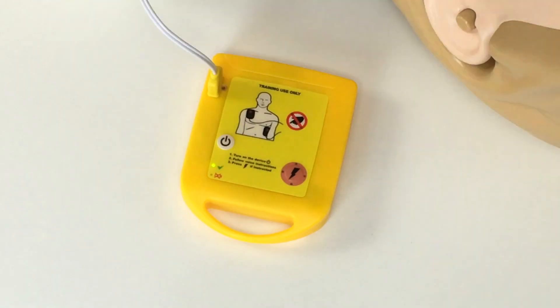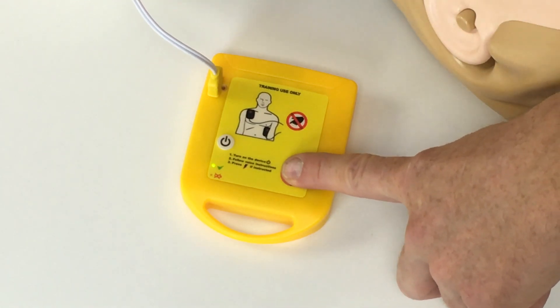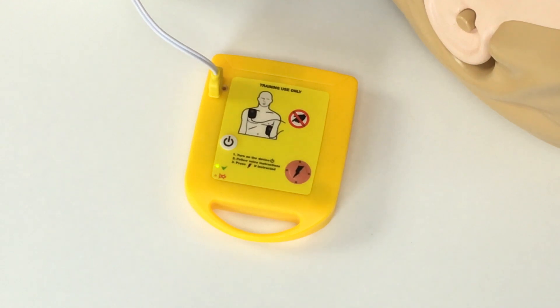Analyzing heart rhythm. Do not touch the patient. Shock advised. Charging. Stay clear of the patient. Deliver shock now. Press the orange button now. Shock delivered. Start CPR.